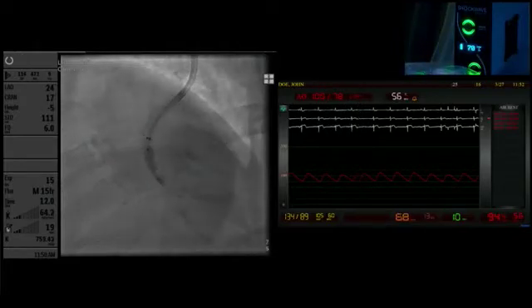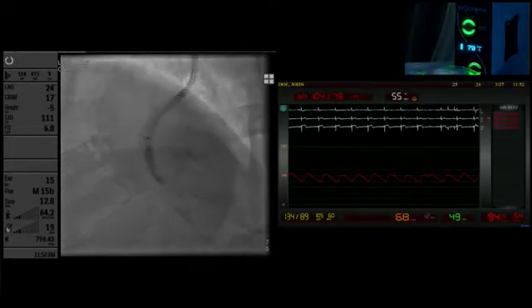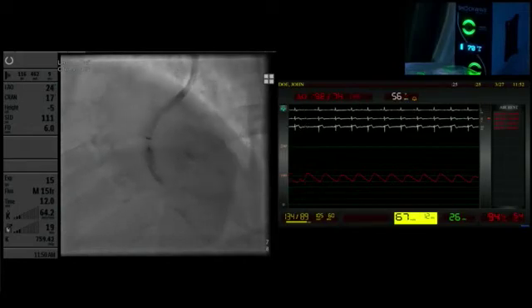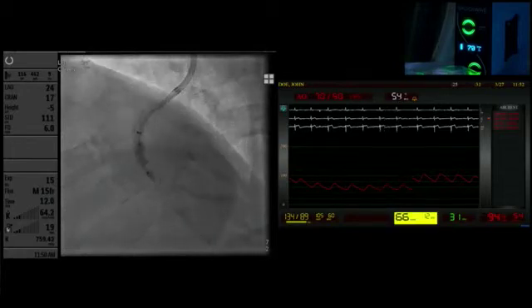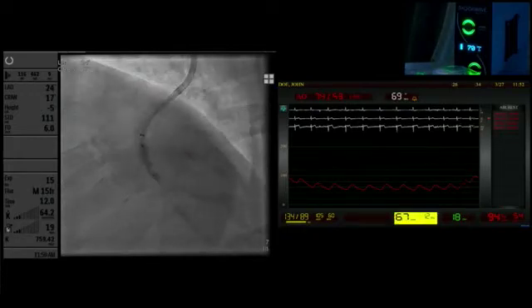I think this goes all the way. That wasn't there. It's a cavitation bubble, yeah. And then we're down. Do you think there's an indent though in the middle of the balloon? There was an indent, for sure. Yeah, it will be. We'll see if that goes away. Yeah, you can see it goes up to 80. That was at 6 atmospheres, the indent, right? The indent was at 4.